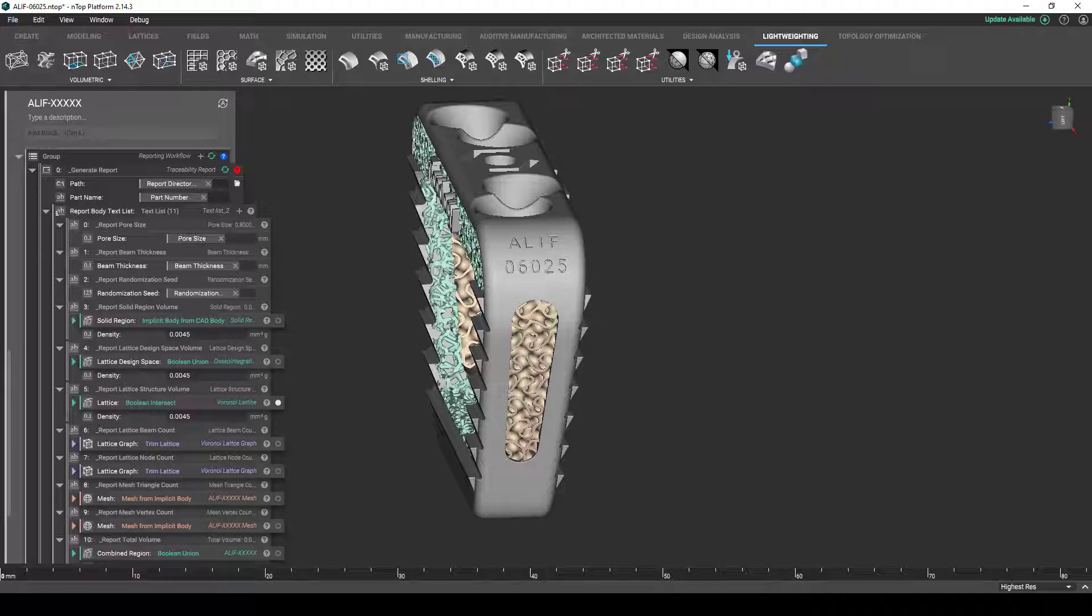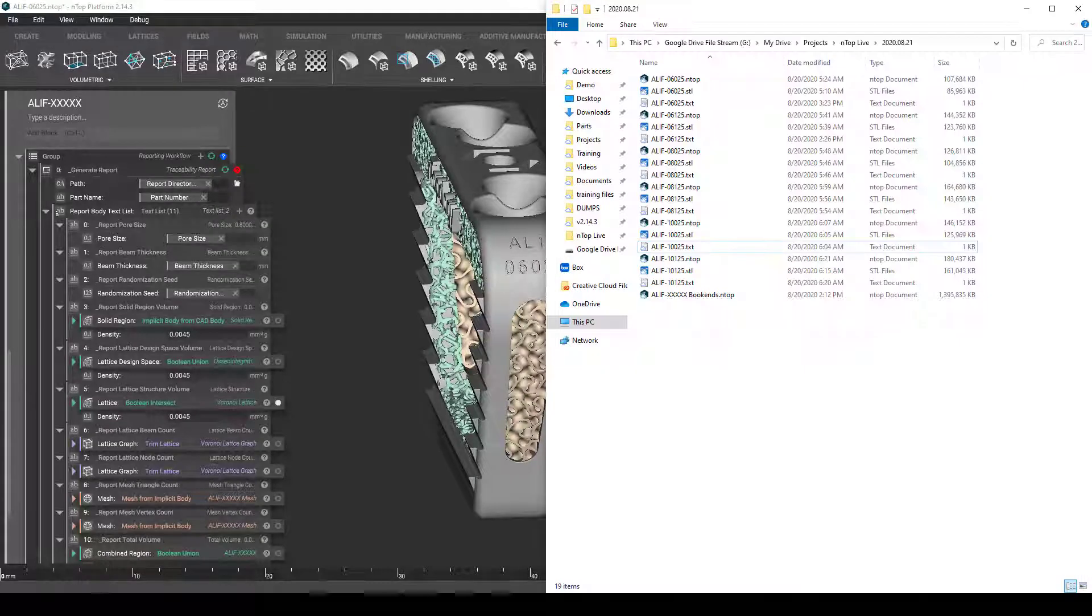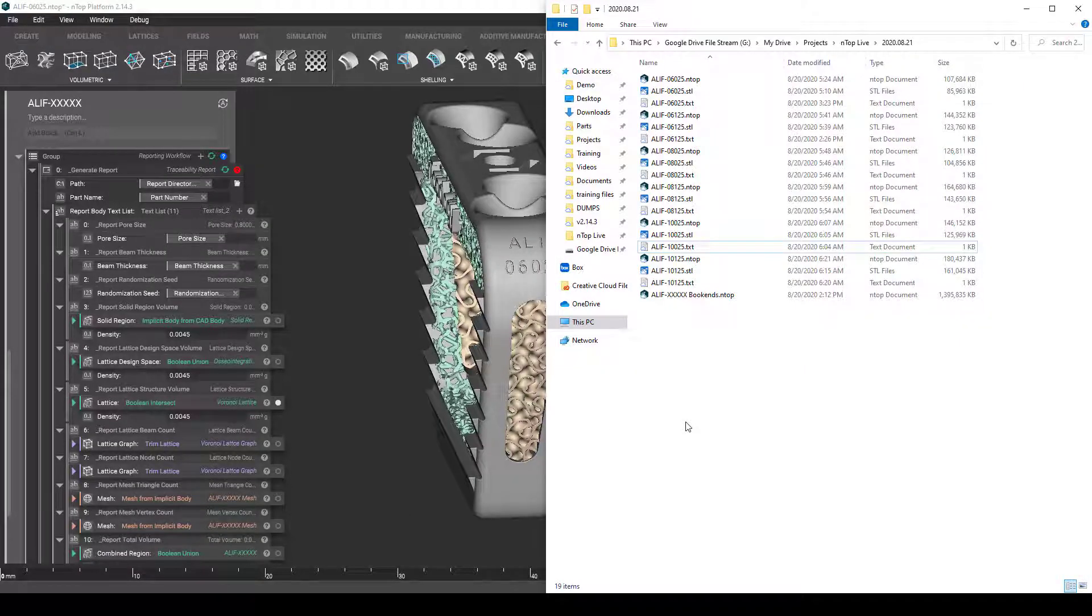So if I jump over to this folder that I have here, I have six bookend sizes of my larger product family, each with their own STL file and text file report with associated properties.